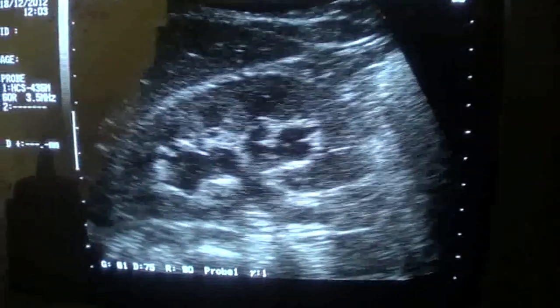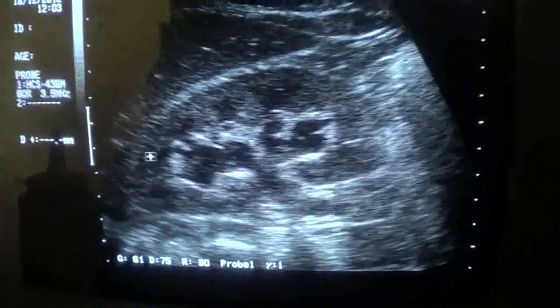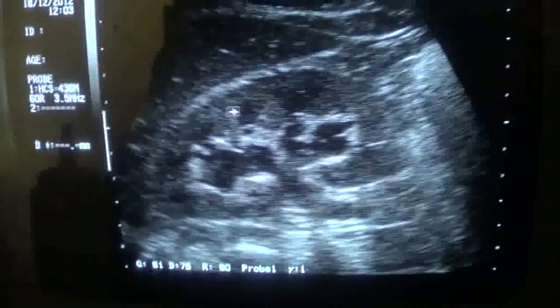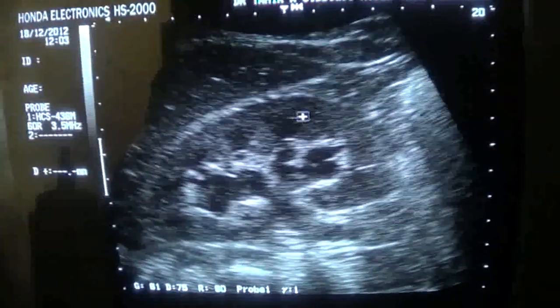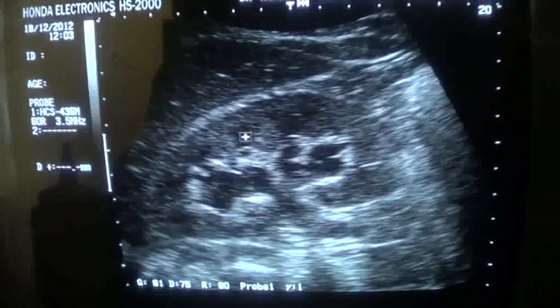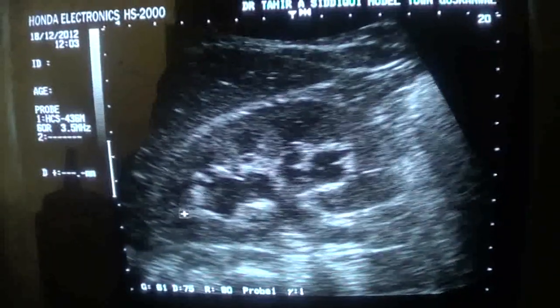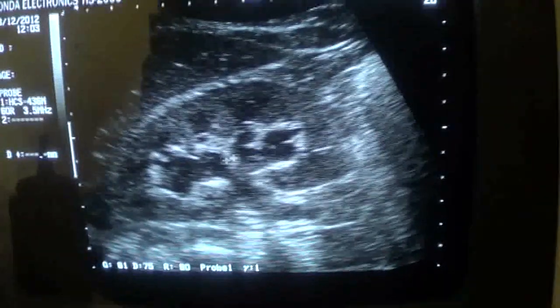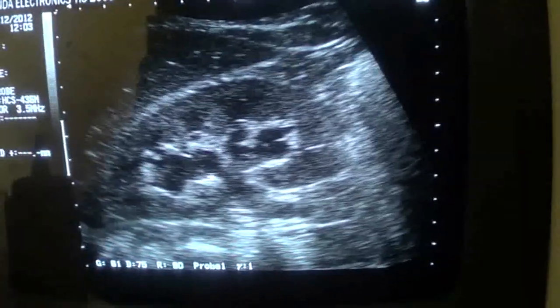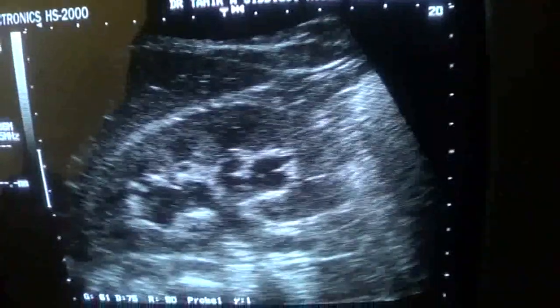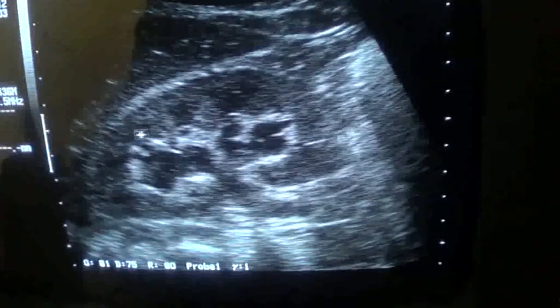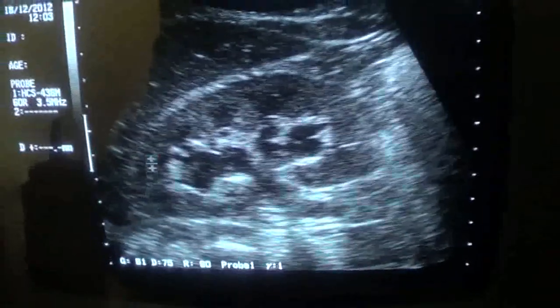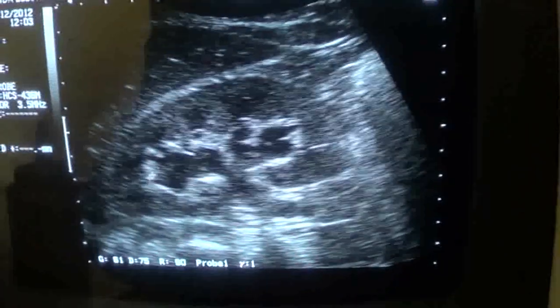Here you can see cystic areas 1, 2, 3, 4, 5, and you can see that these are separate from the central sinus dilated collecting system. And these are the pyramids — the renal pyramids — and these should not be confused with dilated calyces. These are the dilated calyces.